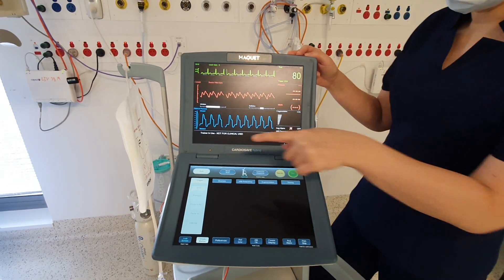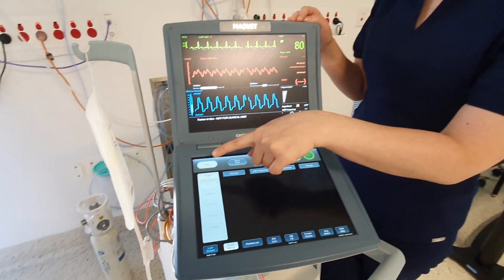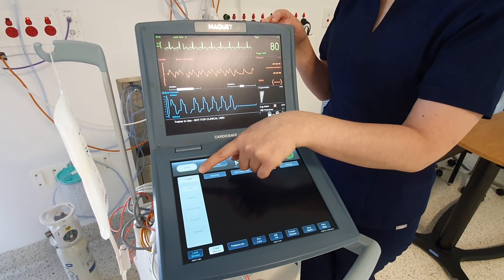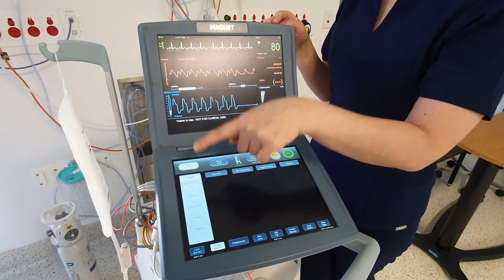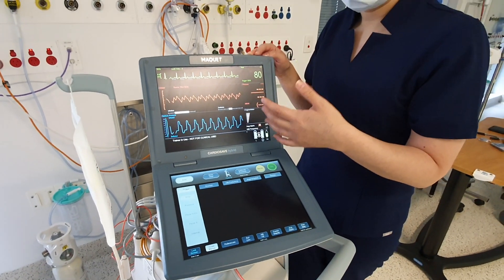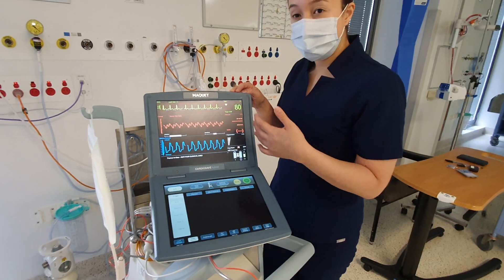The balloon pump should always be left in auto and the trigger as ECG — even if they go into AF, the balloon pump should be left in auto and trigger as ECG. If you have a cardiac arrest and you're doing CPR, that's when you will change the trigger to pressure.